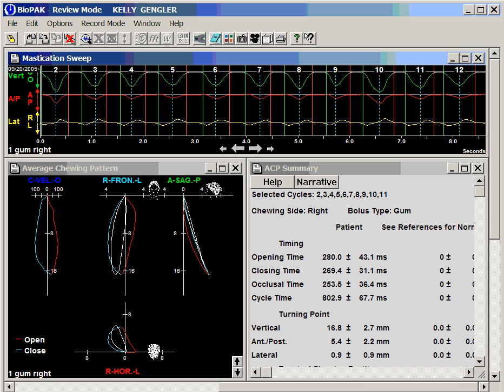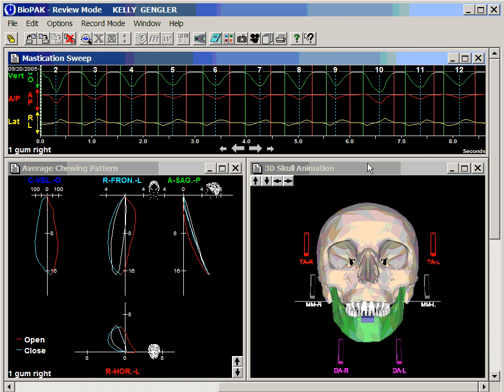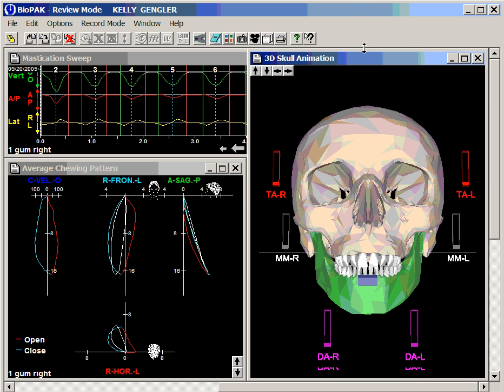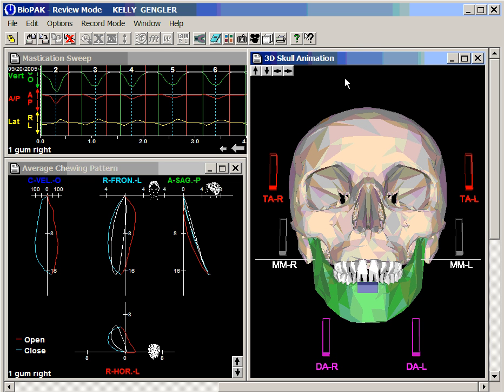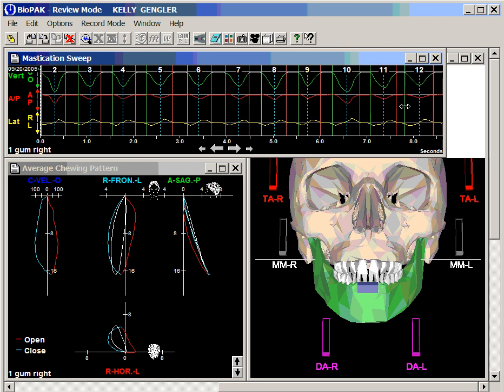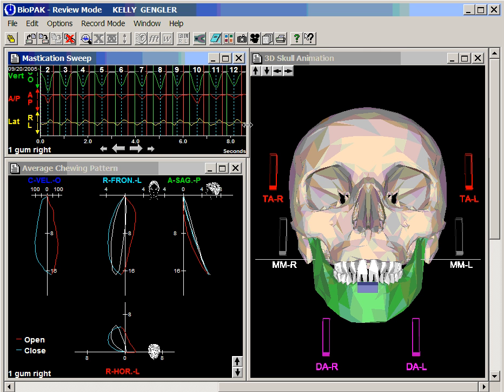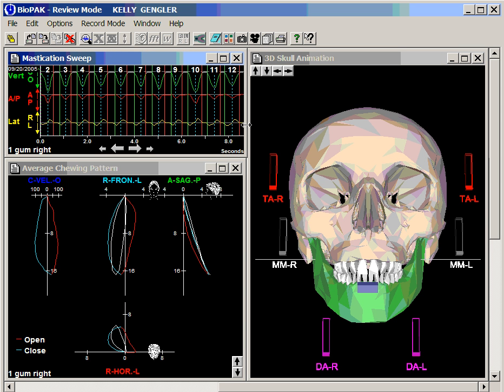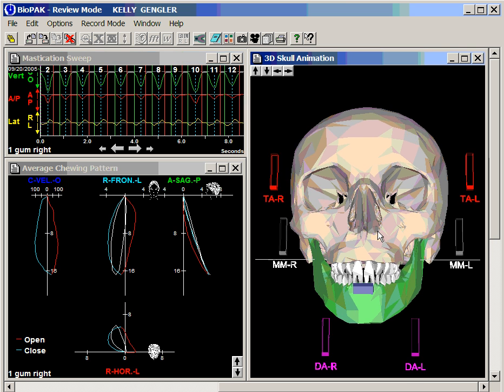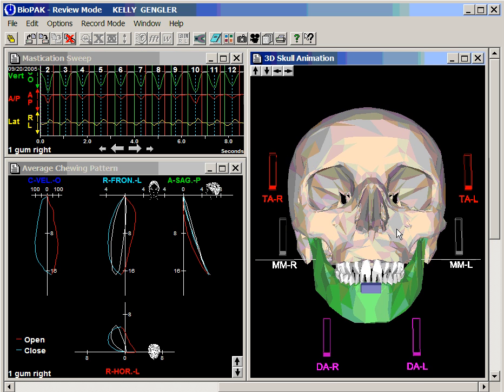Now we are going to observe the same normal subject again chewing gum, and this time we will observe this as a three-dimensional animation. We will observe the cursor moving across the data while we observe the skull being animated by the data.